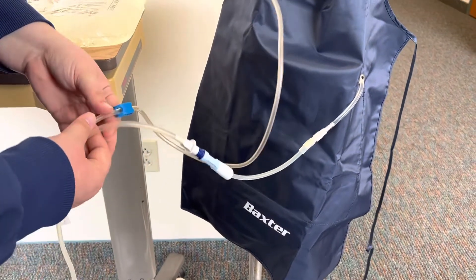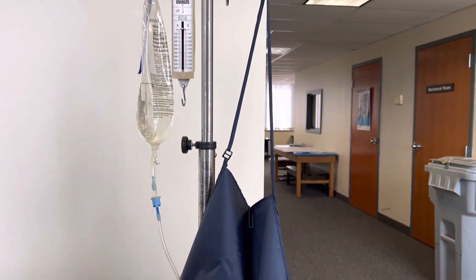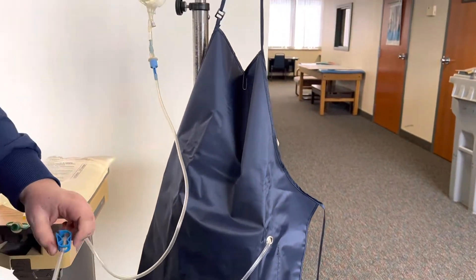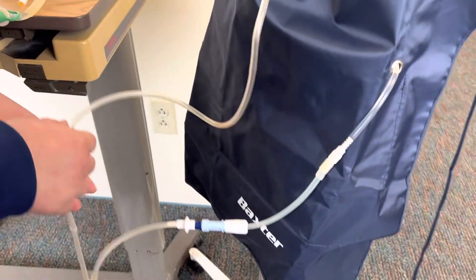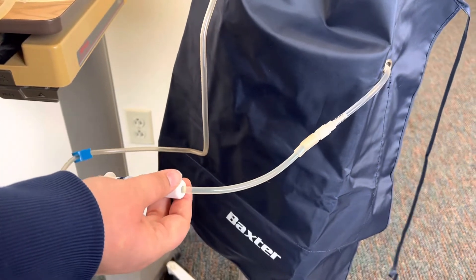While you're doing this, make note that the patient is tolerating it okay and they're not having any abdominal cramping. Once this is completed — it only takes about 10 to 20 minutes — you're going to clamp this off, make sure the patient's feeling okay, and then we've completed the entire process.